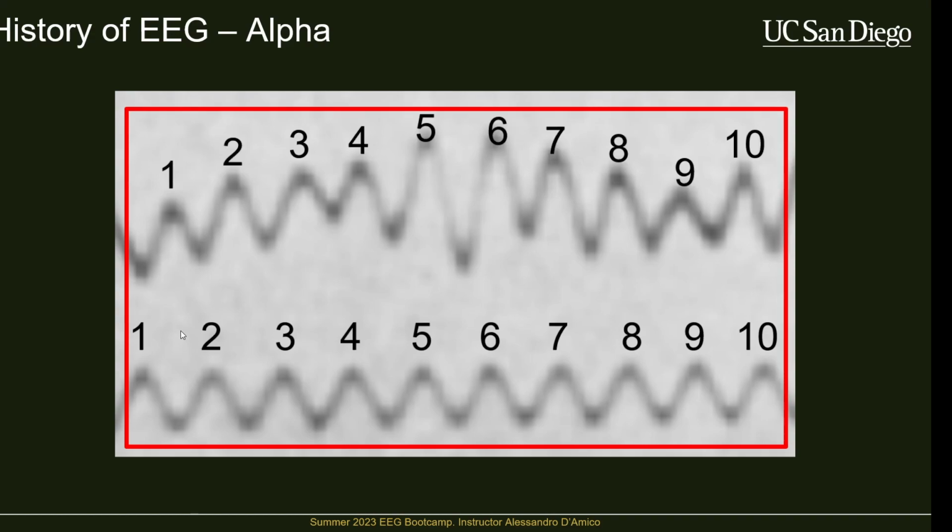And we can do that exact same counting on the peak above, and we see that it's also 10 hertz. It's not in phase, right? It's actually exactly off phase. What I mean by that is that the peak of the perfect sinusoid corresponds with the trough of Klaus's activity. But this oscillation was the very first human EEG activity ever recorded and the very first EEG phenomenon discovered.